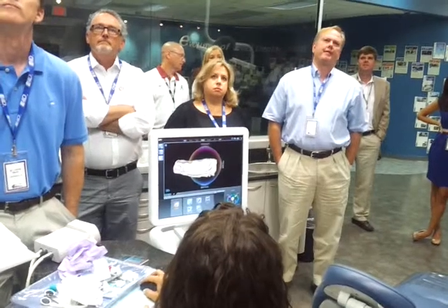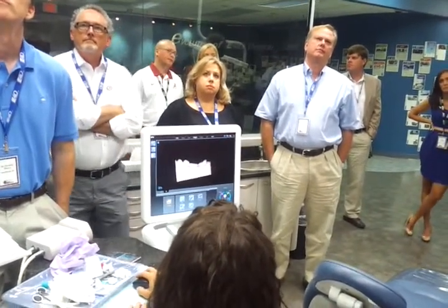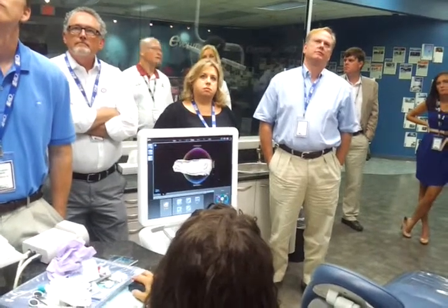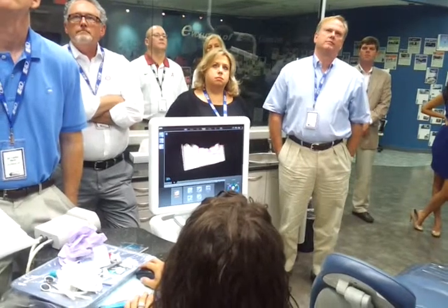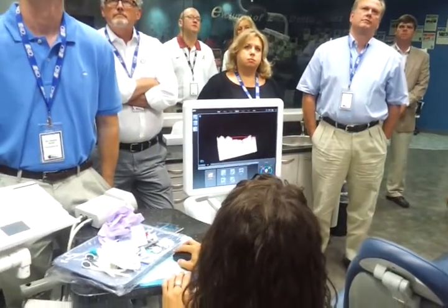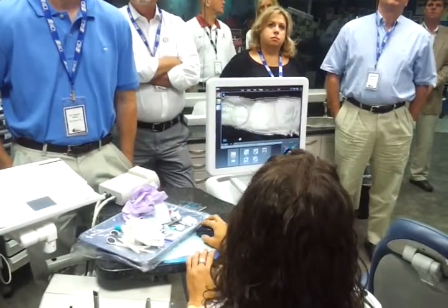So here's tooth number 18. I'm just going to do the very same thing here. Double check it from my buccal view. And this isn't rocket science. It isn't that if your orientation's off, nothing's going to fit. That's not the way it works here. It's just as long as it's within ballpark. So I'm good to go. My orientation is now set, and I'm going to mark my margins.